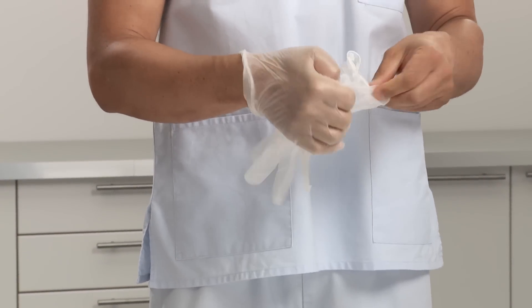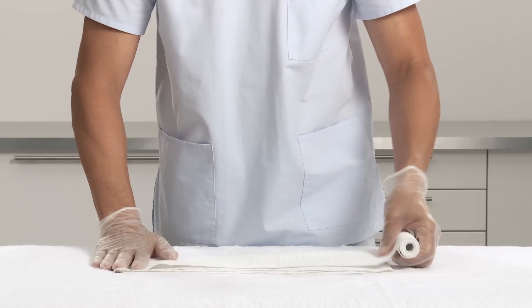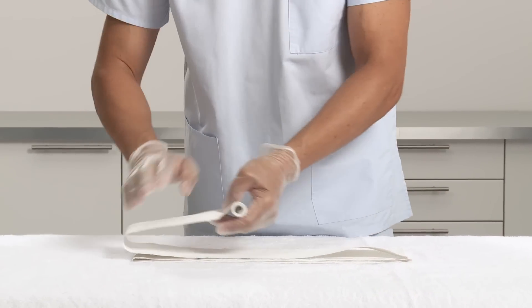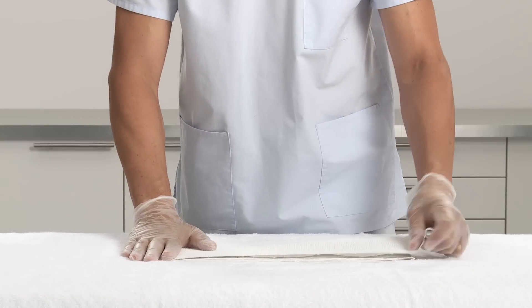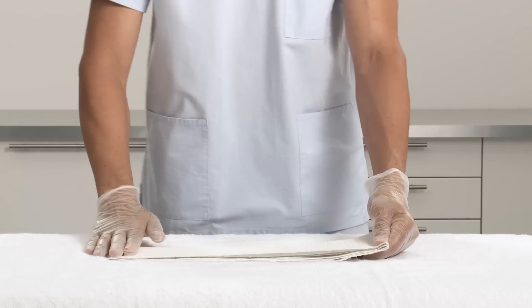It's recommended to wear protective gloves before applying plaster of Paris. Select the appropriate width of the plaster of Paris bandage. Measure the bandage from the metacarpals to 2 finger widths distally to the elbow crease and fold into 6 layers in a zig-zag shape.